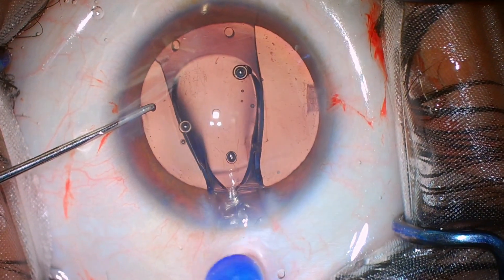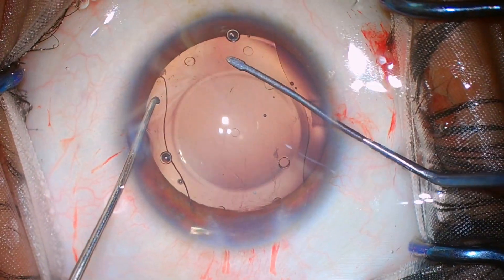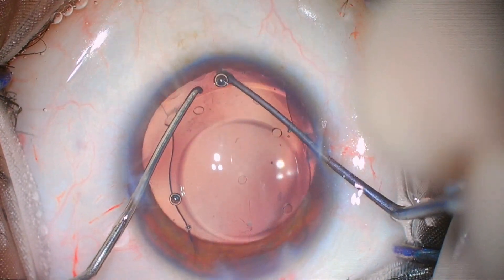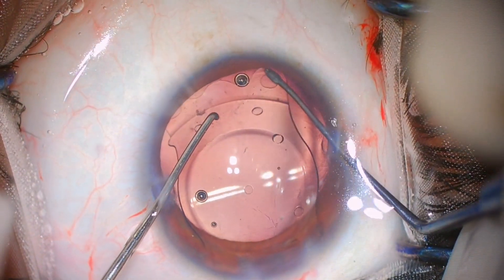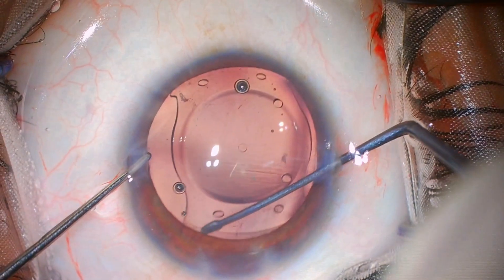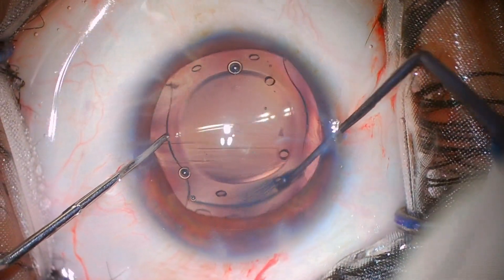You can see that it has gone in well in the proper direction. You can see the directional knob on the leading haptic is on the left side. Now I am going to nudge the haptics of this IPCL under the iris. It's a very easy phakic IOL to maneuver inside the eye and delivers very predictable refractive results.